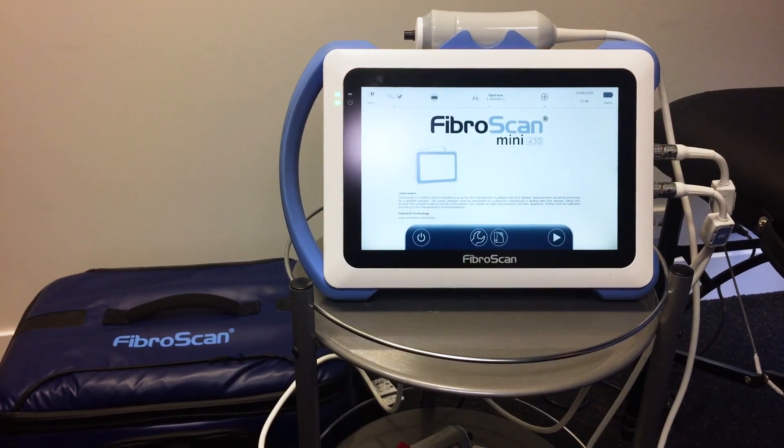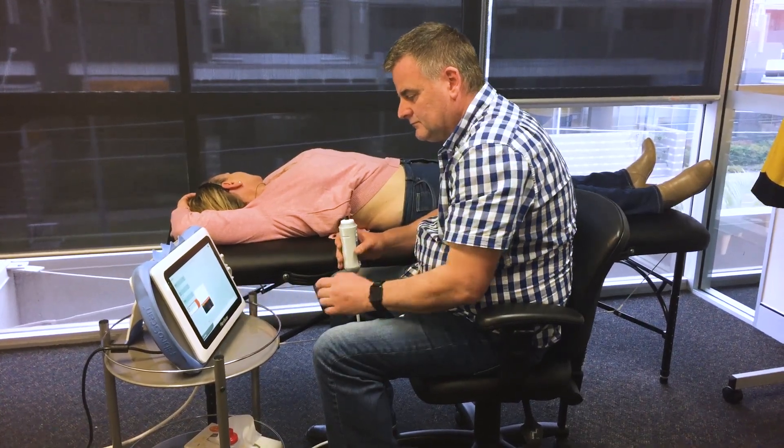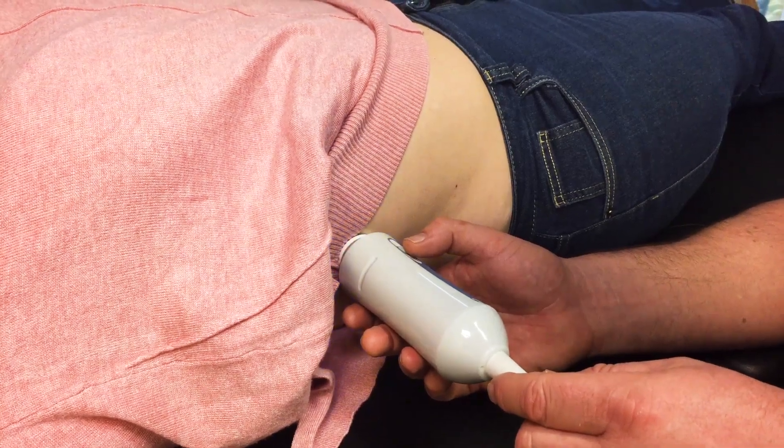The FibroScan is used to measure the liver stiffness or to measure the fat in the liver. The FibroScan is not painful, the FibroScan is not invasive, there's no needles or anything like that. All you feel is a few taps against the body to do the measurements.